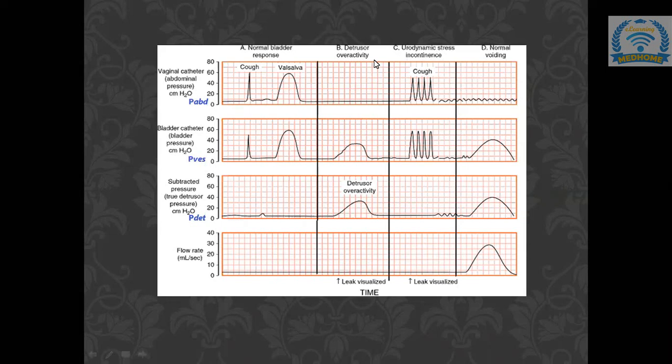Ma'am, I want to ask one thing. We are following graphs. That's why we should say urodynamic stress incontinence. Yes.